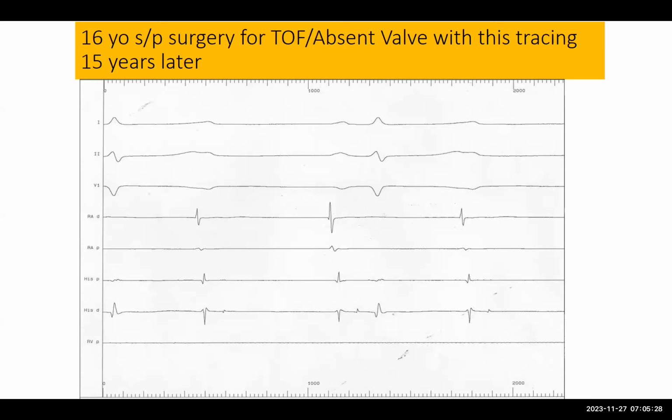I think in the AV node. You had a 50. Okay, so it's in the His. Sorry.